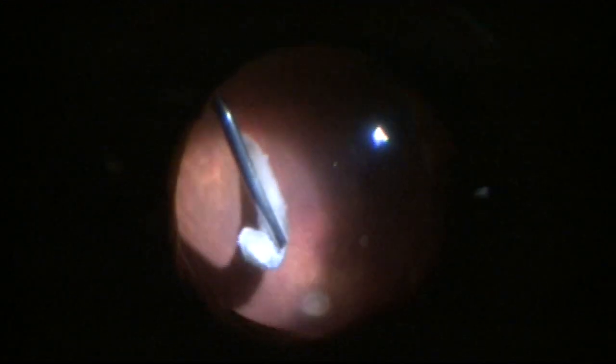So I'm going to go back and pick this up and try to use the vitrector to nibble this up, but that is clearly not going to work. I've edited out a lot of this, but you can see I'm picking this giant piece up a few times trying to gobble it up, but the vitrector has absolutely no effect on it. I change parameters, lower the cut rate, increase the vacuum, and try a few more times, but this is really not successful at all — it's just too big and too hard a fragment.